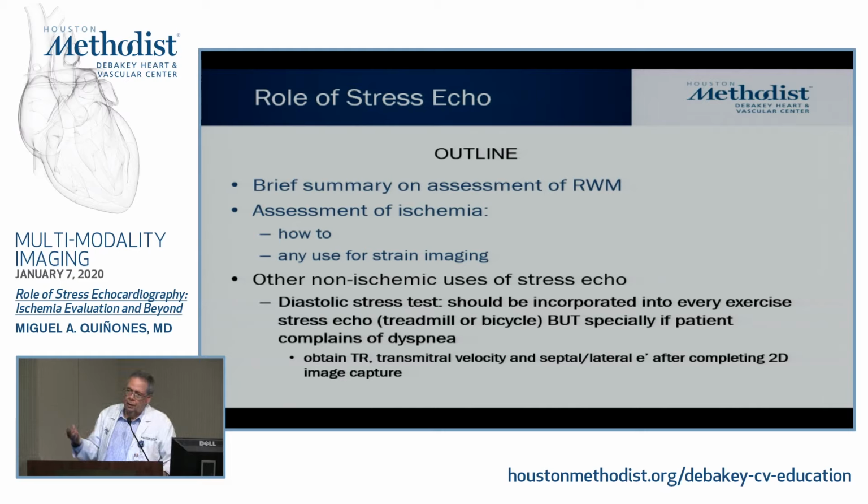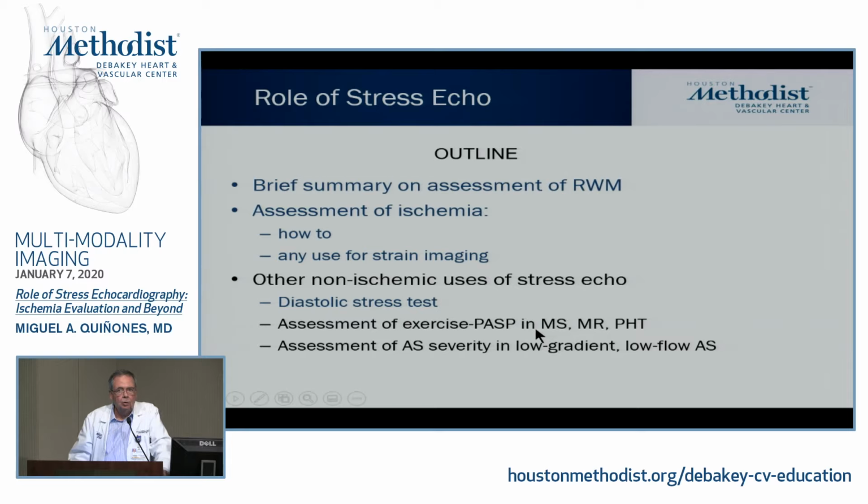And if we don't do it, we miss the opportunity of knowing even more about the potential impact of the ischemia on the physiology of the patient, which also has value in making decisions for treatment and in predicting events in the future. And for people who might have HFpEF that you are not so sure about when you see them in the clinic, adding that component to the stress echo really can be very helpful.